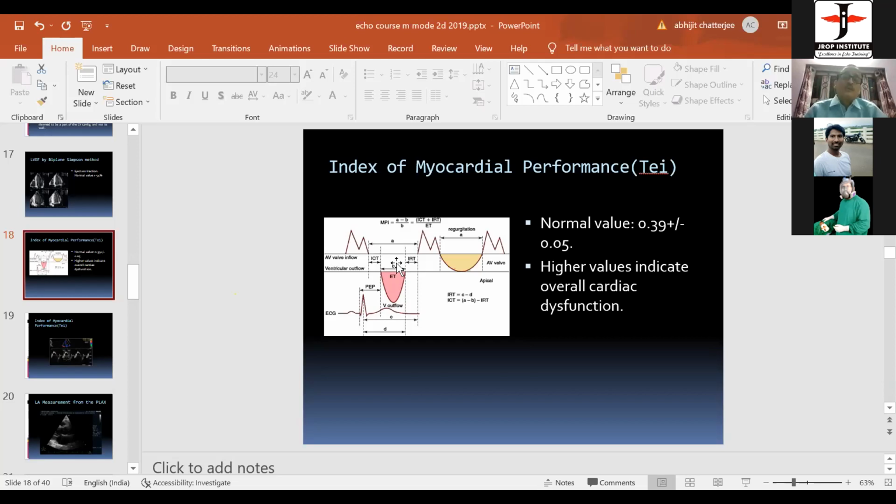Because, you know, most of the adult aortic valve cases are heavily calcified, and then you can't know which is the edge and which is the tissue. And there's a lot of shadowing because of the calcium. The results are all wrong. You have to take the Doppler measurement. Yes, sir. And one more question, sir.